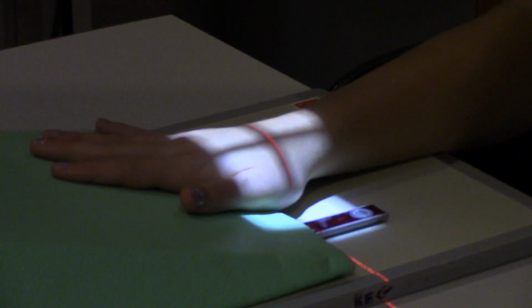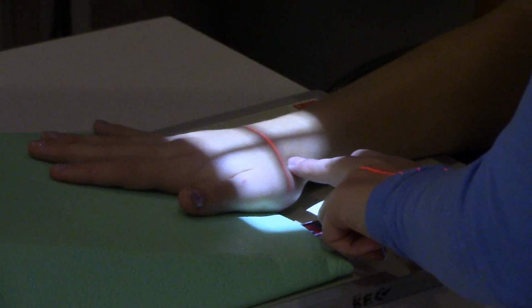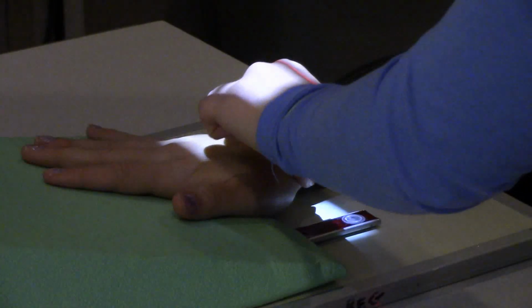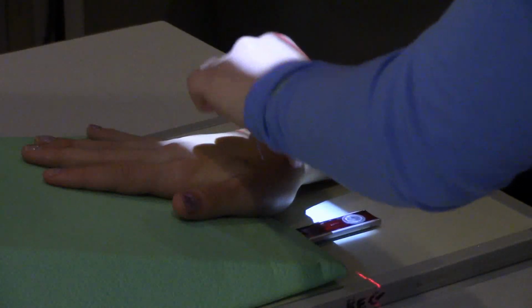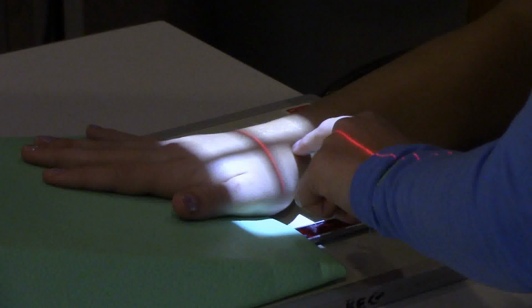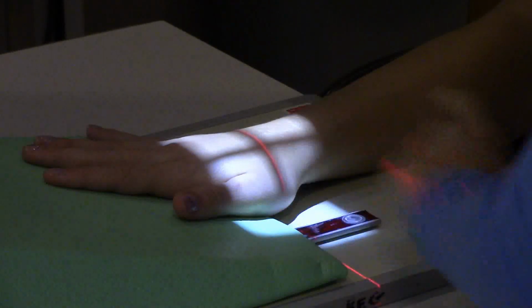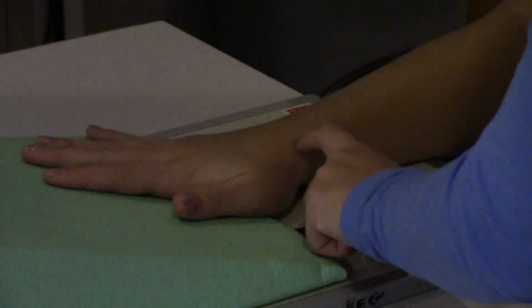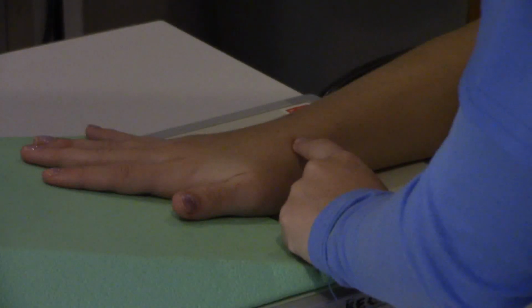And you center, where do you center again? Okay, very good. Try to find the styloid process of the radius, which is right about where your fingers are. And then you're going to go about a half inch, or I think actually it's 3/4, but you know, around a half inch distal and then a half inch medial. And that should put you right on top of the scaphoid.